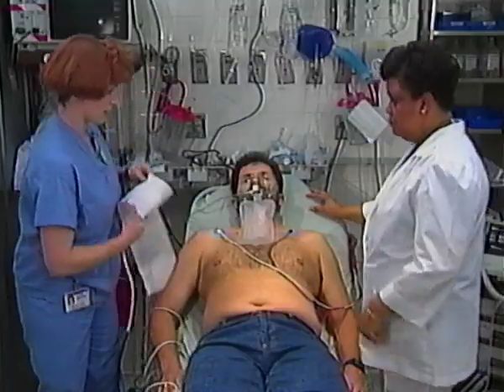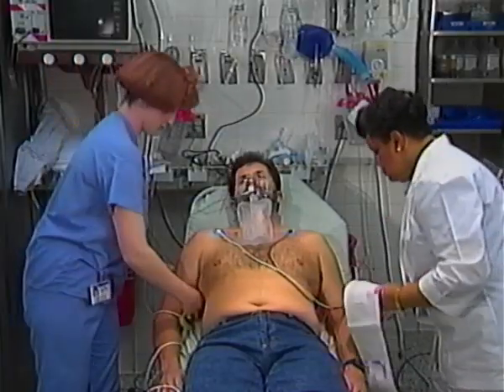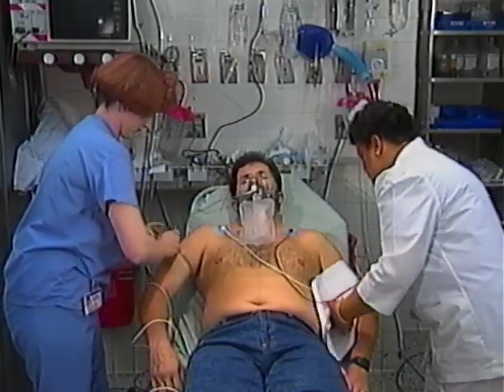If you could put that on the other side for me. So you're going to have a tight rubber band over here on your arm. Mr. Jackson, we're just changing the sides of your blood pressure cuff.